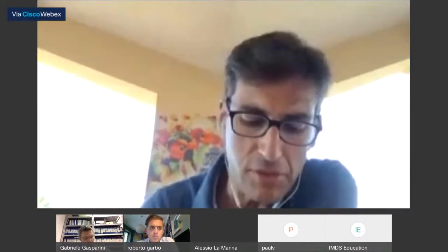Please, Alessio. Yes, unfortunately, there are still no questions, so I invite all the colleagues who are taking part in this webinar to ask questions and make comments, because I think it's very important to discuss these cases that are quite complex, but as you have seen, they have been managed very efficiently with state-of-the-art CTO techniques and devices. So please interact with us.